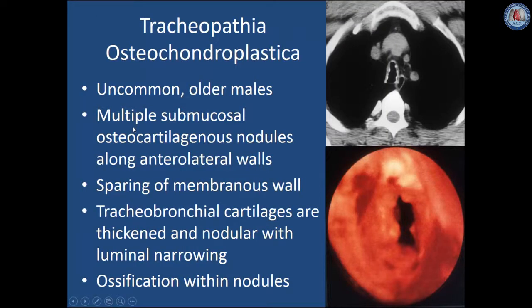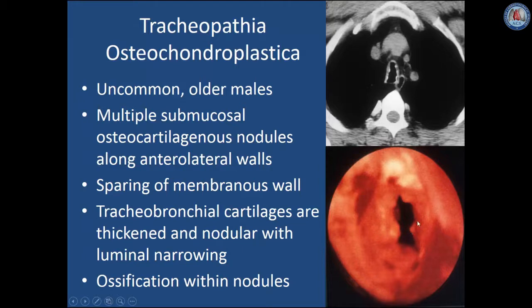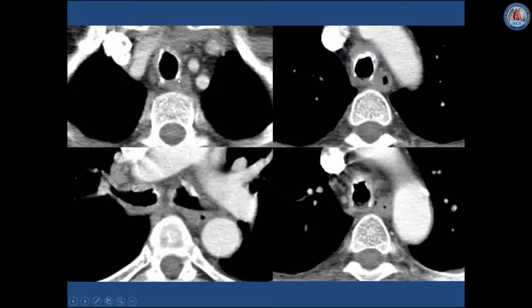Tracheopathia osteochondroplastica is an uncommon disorder seen in older males in which there are multiple submucosal osteocartilaginous nodules that form along the anterior and lateral walls of the trachea, also sparing the membranous wall. Tracheobronchial cartilages are thickened and become nodular, causing luminal narrowing, and ossification can form within the nodules. On the axial image, notice the nodularity and thickening of the anterior and lateral walls with ossification, and the correlative bronchoscopic image demonstrates these nodular submucosal deposits protruding into the airway. In a different patient, ossification within nodular areas of thickening is again seen in the cartilaginous portions of the tracheal and bronchial walls.